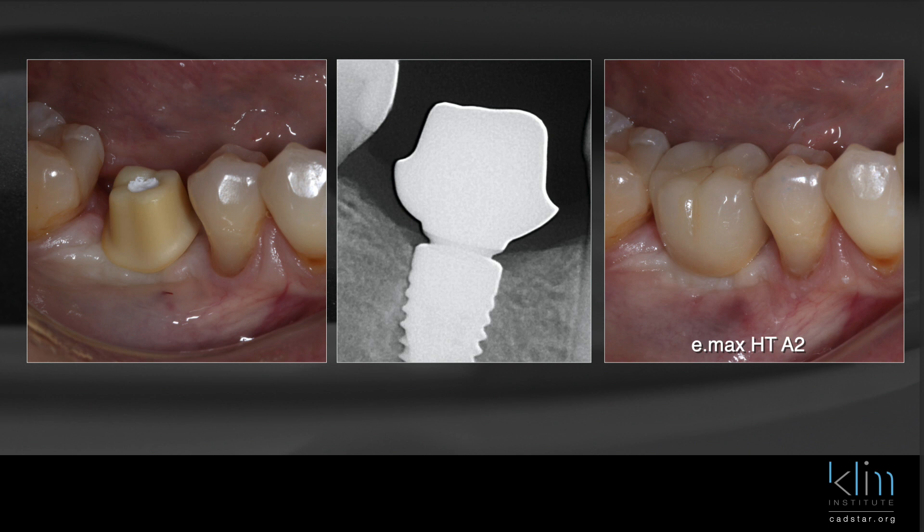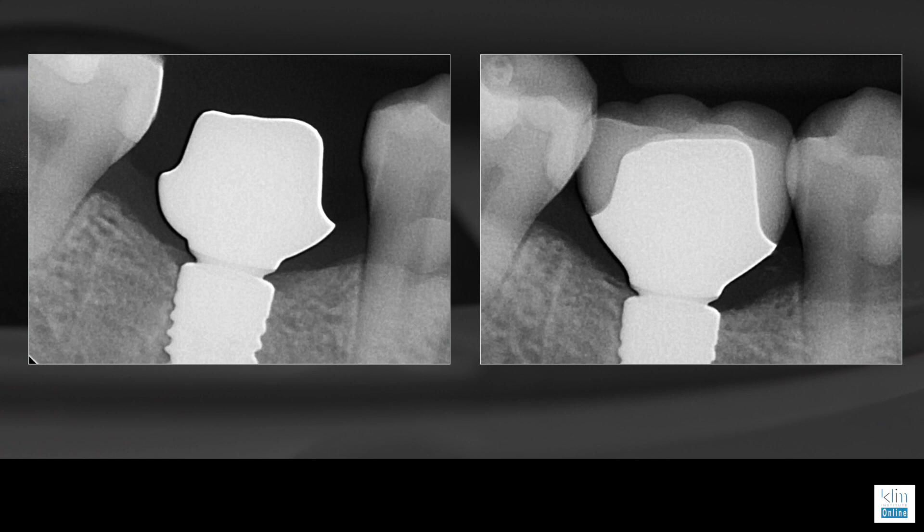This is an Emax A2 to match the second premolar. We did use Mio to tone in the color of that crown. When we cement on a toned-down zirconia abutment, it has that rich color that shines through the cervical area. We did not drop the margins on this zirconia abutment and we still get a nice blend in that zone. This is the basic approach — tone it down with infiltration to get a warmer color, and when you cement your final restoration it looks really nice. It's a routine procedure in my clinical theater.